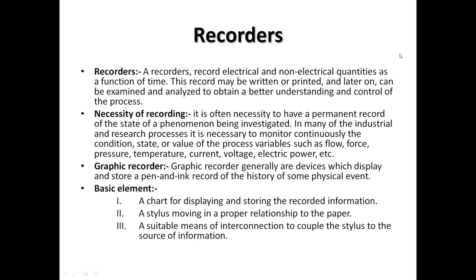So we have biological recorders in biopotential and biotelemetry. We have biotelemetry, biopotential amplifiers, and later recorders. These are the basic recorders. What is the simple definition or purpose of recorders? Recorders record electrical and non-electrical quantities as a function of time. This record may be written or printed, and later it can be examined and analyzed to obtain a better understanding and control of the process.